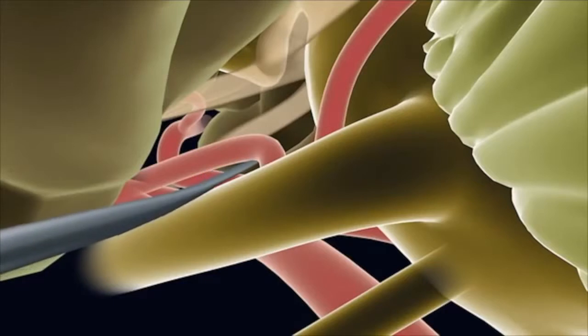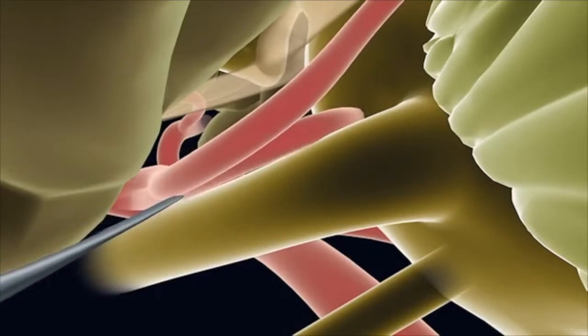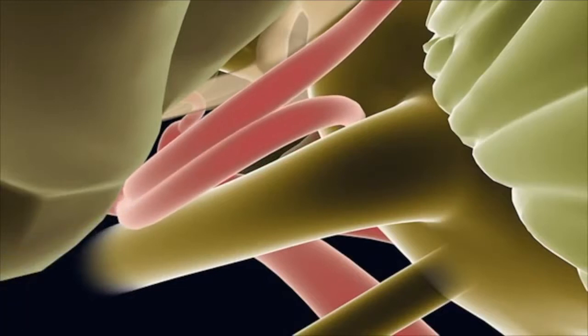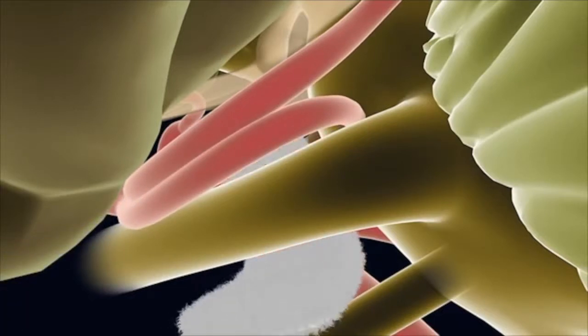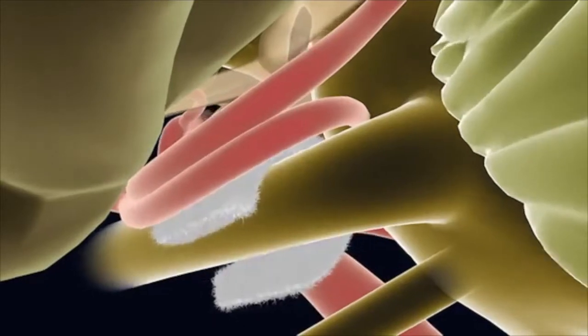In this case of trigeminal neuralgia, the blood vessels that are compressing the nerve are identified and the neurosurgeon delicately separates them away from the nerve with a small piece of Teflon felt, leaving a space in between the nerve and vessel.